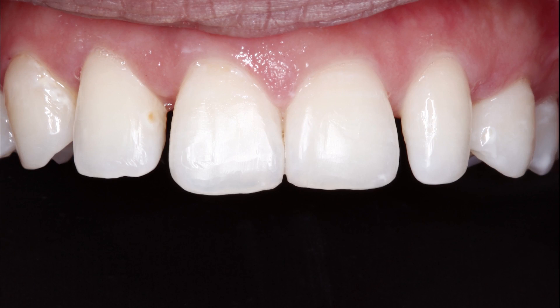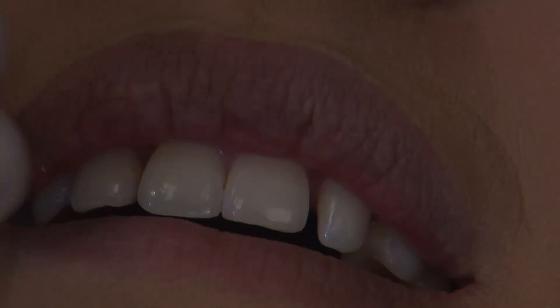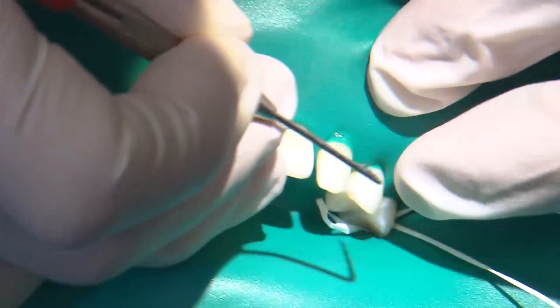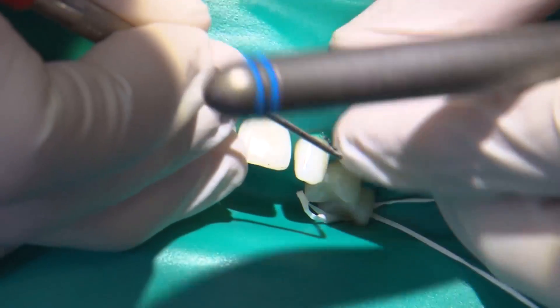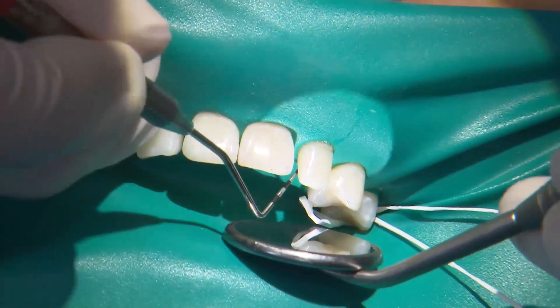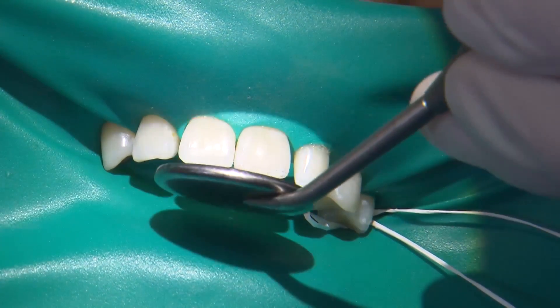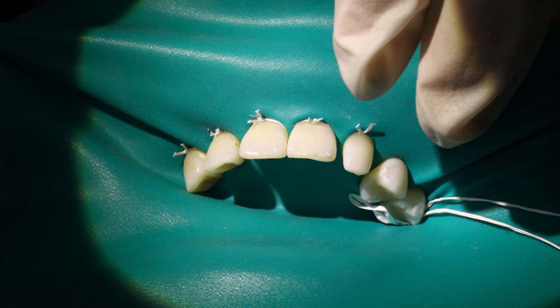At the start of the case I do recommend using a prophy cup and pumice to ensure the tooth surfaces are nice and clean. If there is calculus present it would be prudent to scale those areas to achieve the best possible bonding surface. I place a rubber dam because isolation is very important to avoid contamination since I will perform bonding procedures on multiple teeth. I use the second to smallest hole punch so it will be more constricting at the base of each tooth. For additional stability I place individual floss ligatures, which also help expose more tooth structure by displacing the soft tissue more apically.